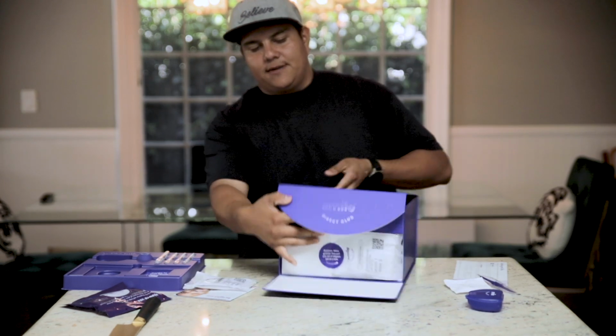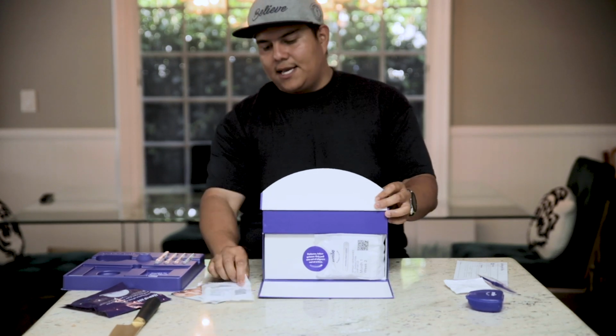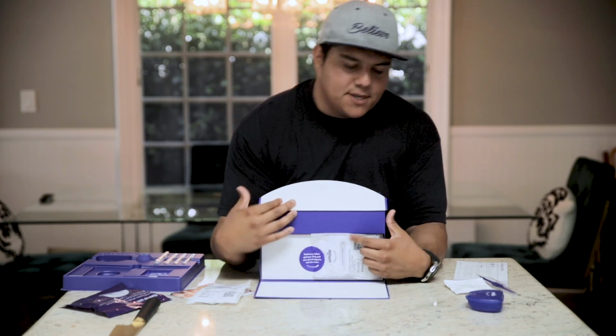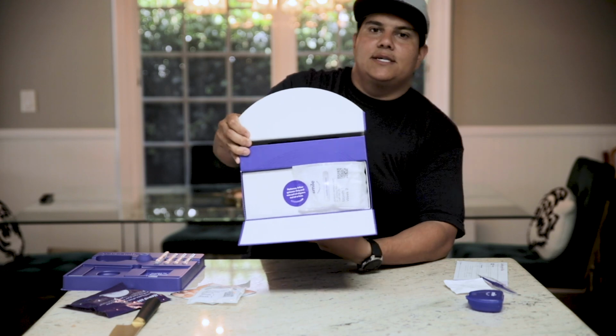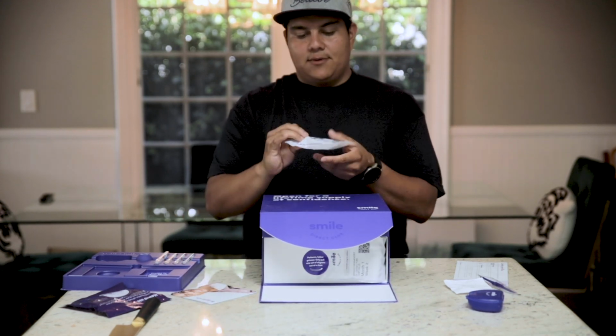If you guys see there, what I did was I pulled these out and I yanked it, and then I took it off of the little sticker and I put basically the next one out. So I didn't even read it. What does this say? Month 1, week 2. So pretty easy. And now we can remove these.